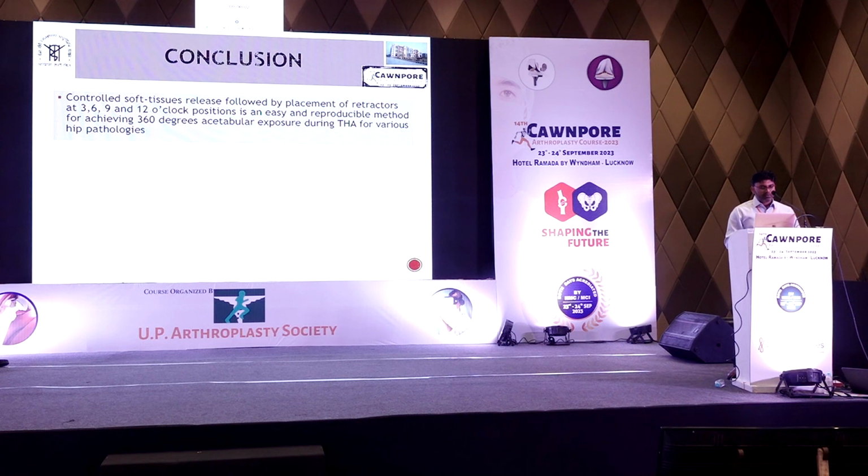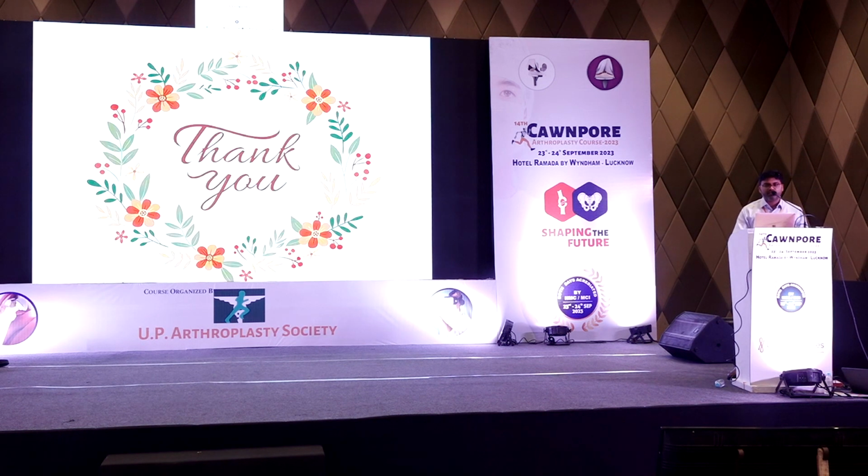Now to conclude this case series, I would say that a controlled soft tissue release followed by placement of retractors at 3, 6, 9 and 12 o'clock positions is an easy and reproducible method for achieving 360 degrees acetabular exposure during total hip arthroplasties for various hip pathologies. Thank you so very much.